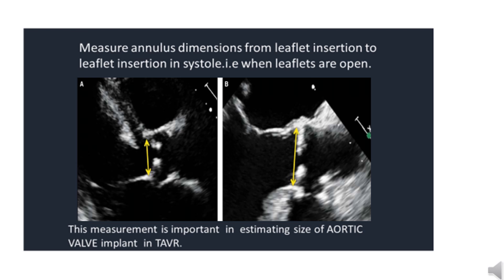The aortic annulus measurement is done from inner edge to inner edge, from the point of insertion of one leaflet to the point of insertion of another leaflet. The measurement is done in systole, that is when the leaflets are open. This measurement is important because it helps us calculate the size of the implant for procedures like TAVR.